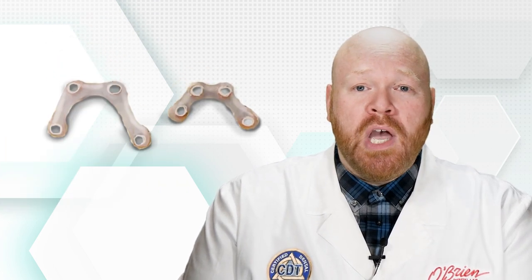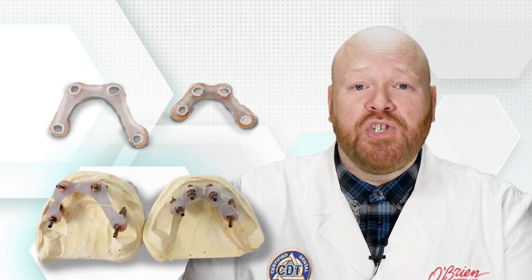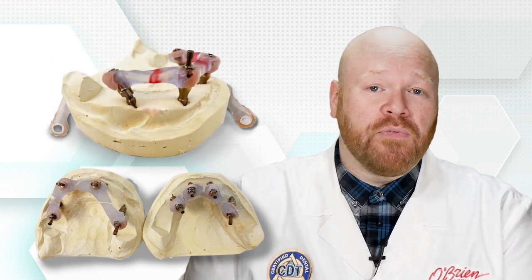After we've created the initial jig, we allow it to sit so that it has time to shrink. We then section the jig between each component and join them back together with resin.